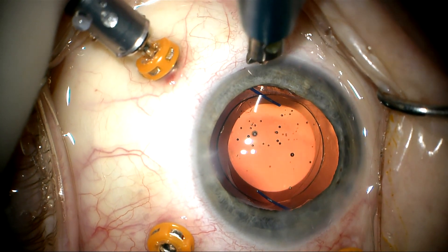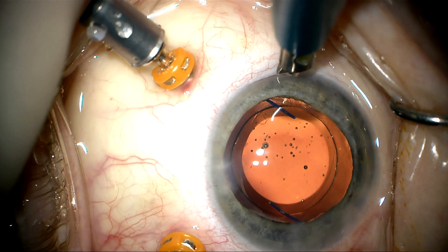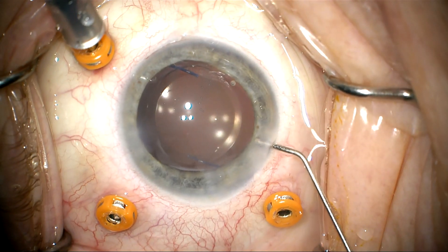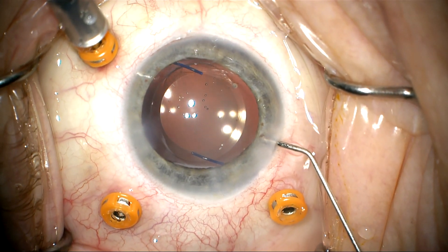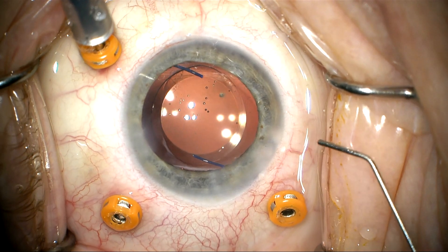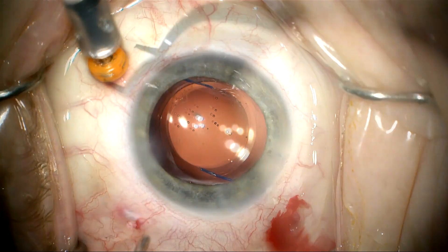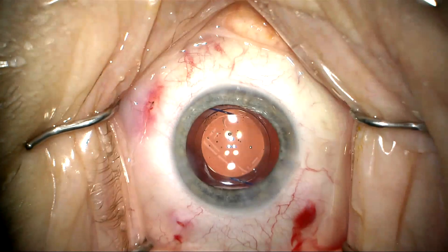We're going to place a limbal relaxing incision here to adjust the patient's against-the-rule astigmatism. I'm staining with dilute triamcinolone to make sure there's no vitreous in the anterior chamber — and that is clear of any vitreous. The trocars are removed and the case is completed.